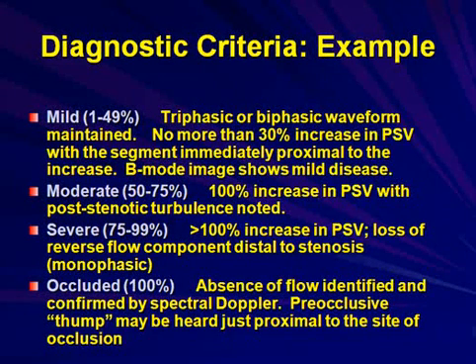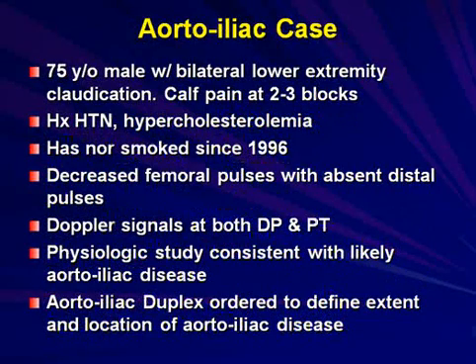Occlusions, of course, you have to confirm the absence of flow, and normally we'll hear a pre-occlusive thump just proximal to the site of that occlusion, and then confirm that it's occluded within the vessel segment that is occluded. So let's look at a case.